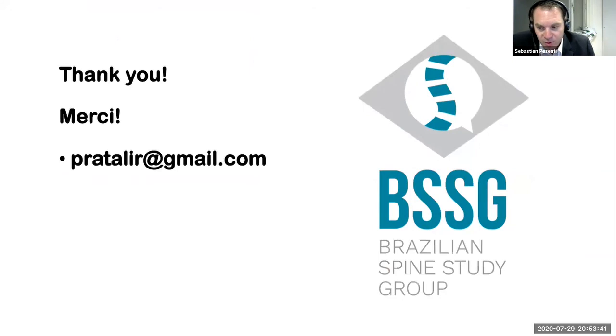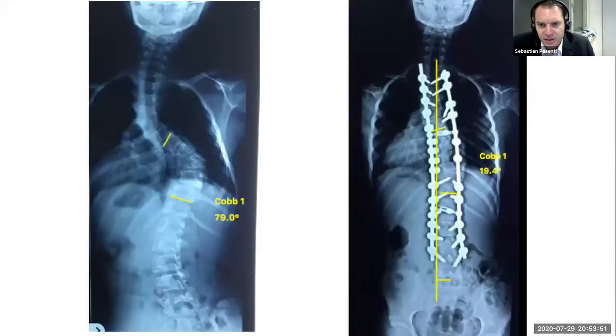But I wanted to know, by putting your screws, how do you manage the correction of the thoracic area? Do you put the screws and then tension the band, and at the end connect the screw to the rod, or how do you manage both implants?